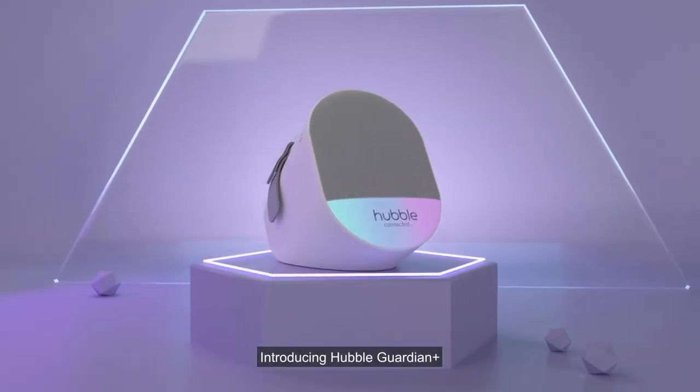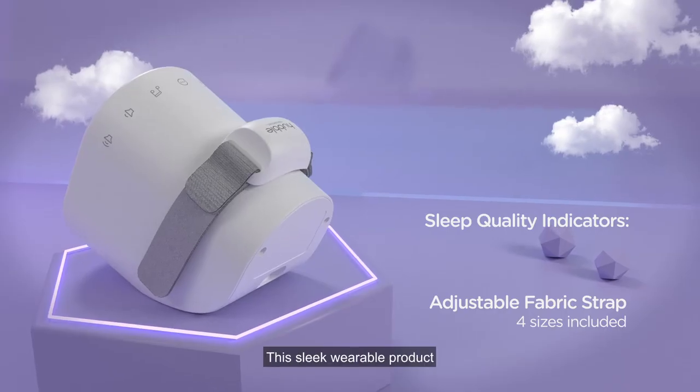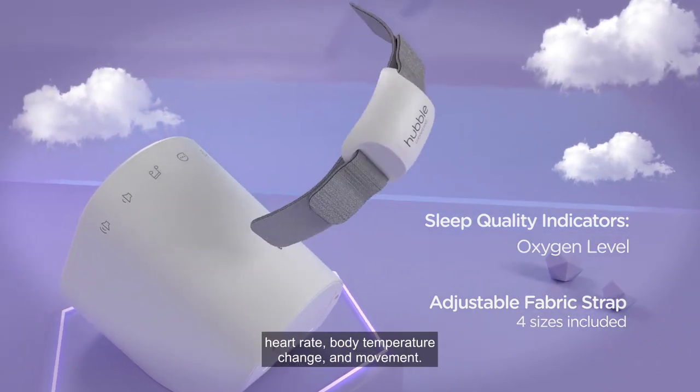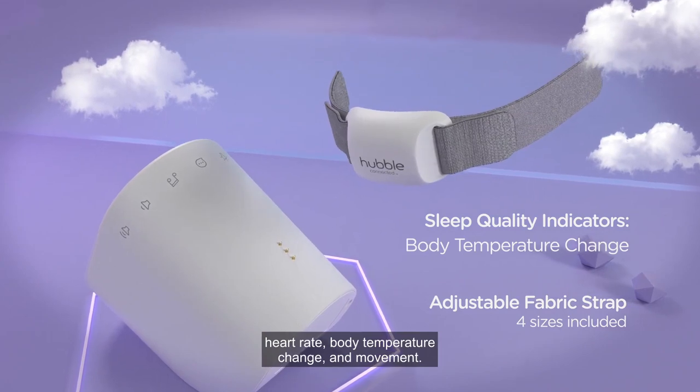Introducing Hubble Guardian Plus from Hubble Connected. This sleek wearable product tracks your baby's sleep quality, oxygen level, heart rate, body temperature change, and movement.